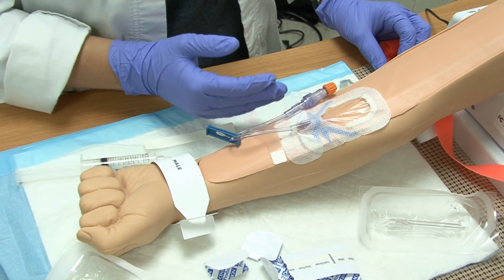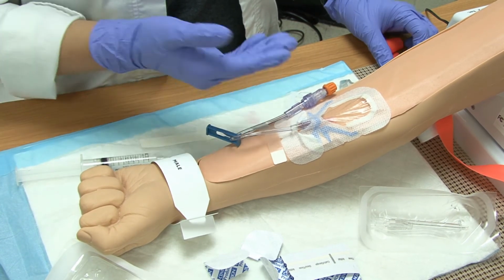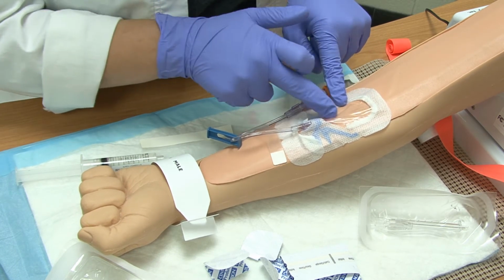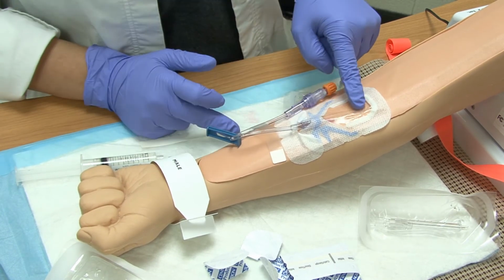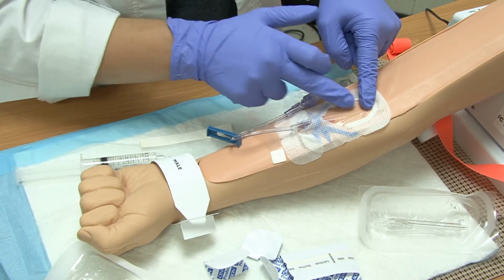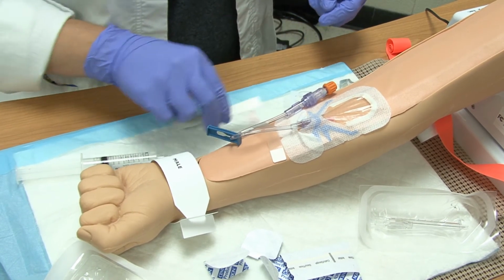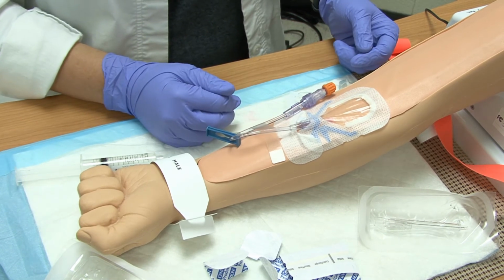When you do your assessments of your IV, if there is swelling, then that could be a sign of infiltration. You're not going to see what we call phlebitis immediately. That takes a little bit of time for it to develop, but typically what you would see would be a little red streak or the swollen part up above the actual IV insertion site, and that would indicate phlebitis. Either of those things would indicate issues with the IV.